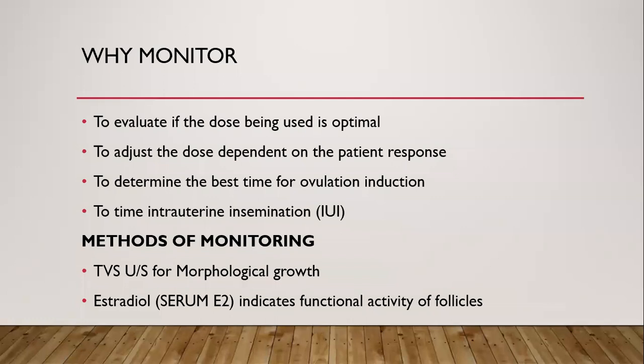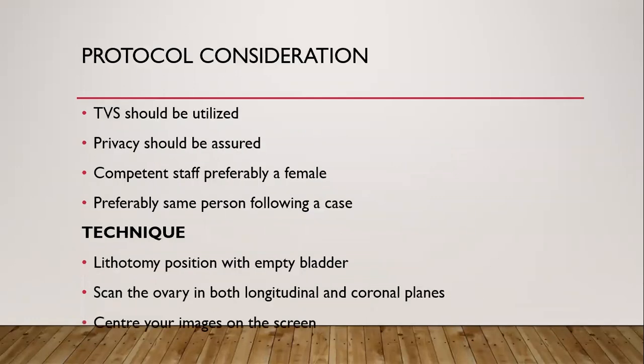This is transvaginal ultrasound. The protocol, in terms of the consideration as we get to scan our mothers, we need to utilize transvaginal ultrasound. I think we cannot emphasize this more. The transvaginal ultrasound is more valuable when you're assessing gynecological conditions.